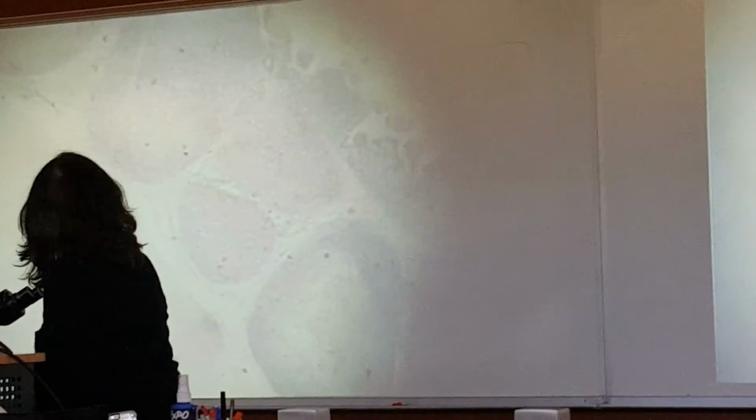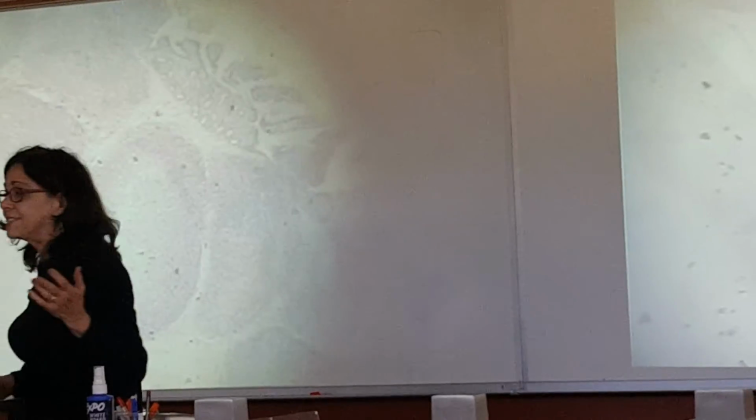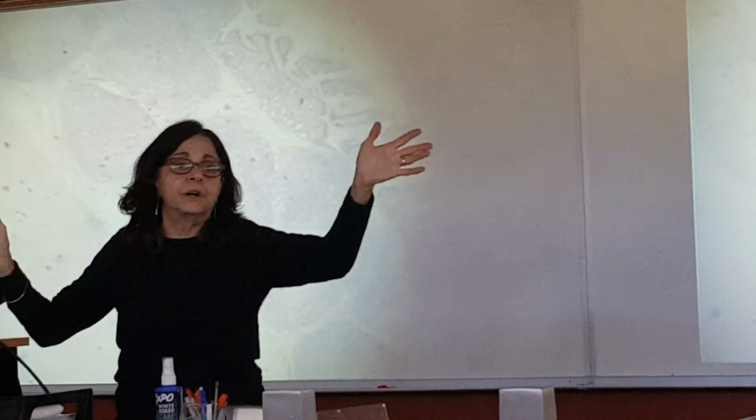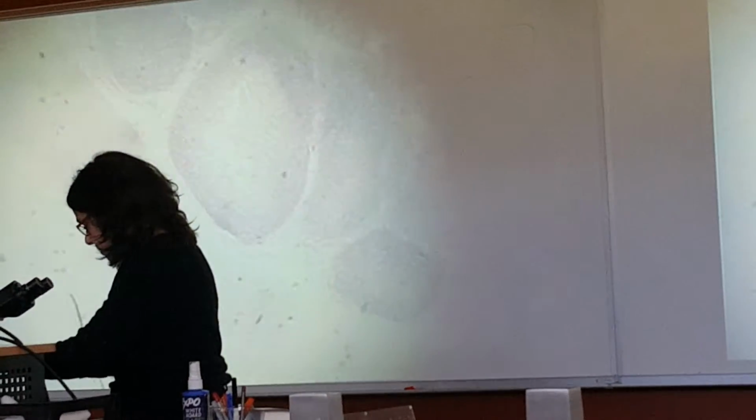Okay, so these are Peyer's patches, and you can probably expect to find a slide like this on the practical, say, duodenum or ileum, and you see Peyer's patches, you know, right? The last part of the small intestine.